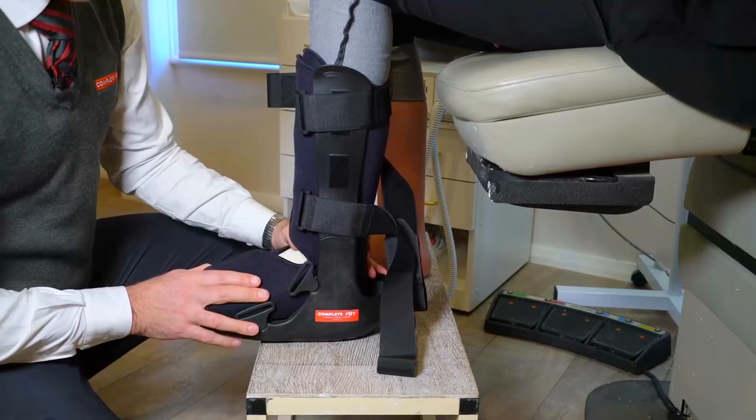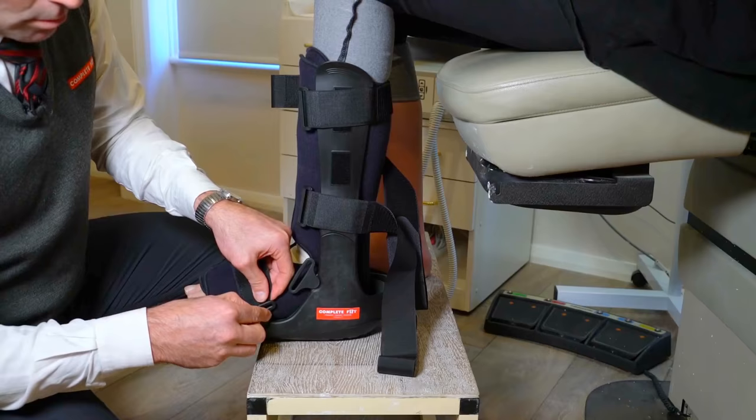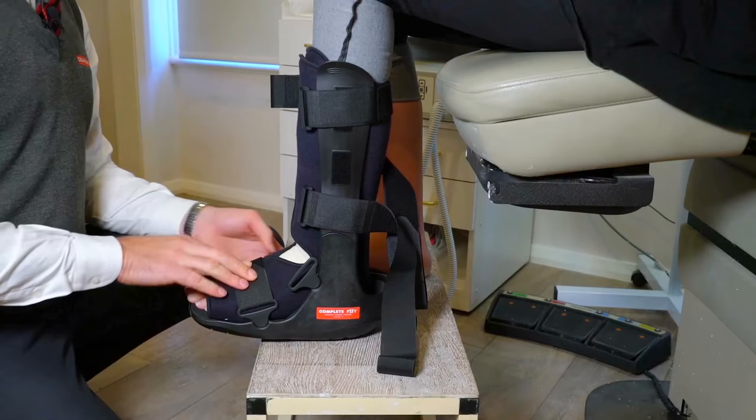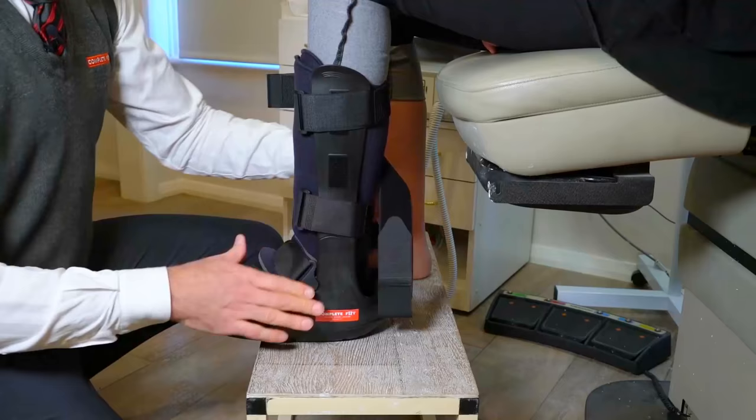This is now being customized for your foot and ankle. We're going to do up the straps and we basically do them from the bottom up — undo the velcro, pop it through the loop on the side, and do it up so it's firm but comfortable. Often we'll put a little pad in the front there. The two bottom straps will help immobilize the foot and ankle.